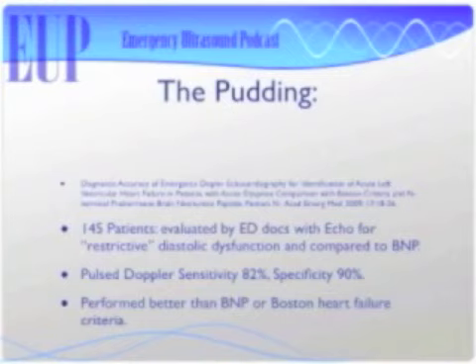So if this sounds like something that is pretty serious to diagnose, and if the sensitivity is only 82%, that worries me a little bit. But you're saying, are these other things, this Boston heart failure criteria thing, what is the gold standard for that? What do we use now? The gold standard they used for this study was basically cardiology's diagnosis. Okay, so I actually don't have a cardiologist always sitting in my ED, so I guess this would be helpful. Yeah. Okay, I got you.